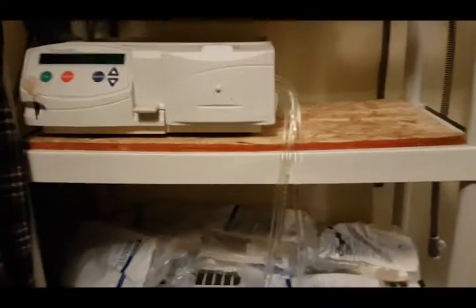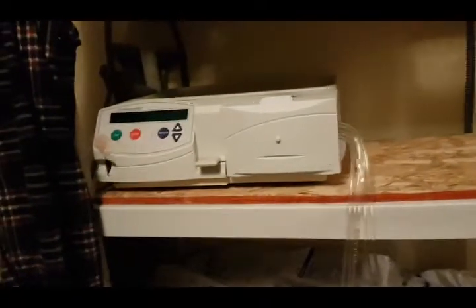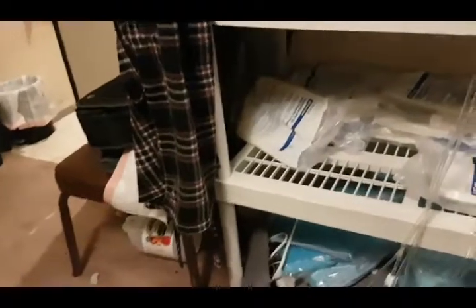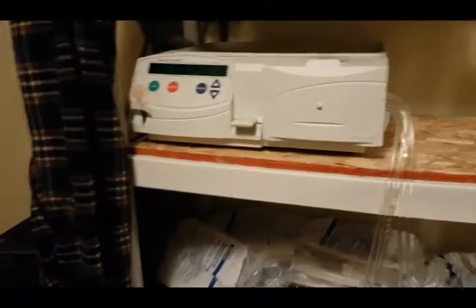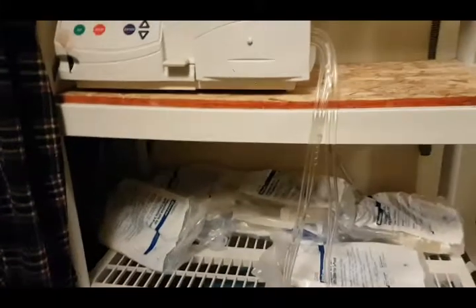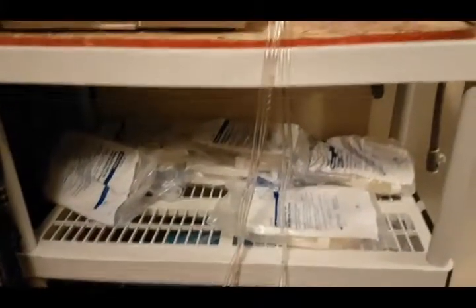And this is a scale that's used. Basically, if you can't get to electricity, or for some other reason, there's something called a manual exchange, which is where you hook one bag up full of solution. You have one bag down on the floor, and you clamp the bag of solution, unclamp the bag to the floor, and let the solution flow out into the waste bag. Then when that's done, you unclamp the tube up to the bag full of solution, let that empty into your abdomen, and then it does the dwell time, and in a few hours, you do it again. And that is basically what I can think of at the moment. We are going to now pause the video and wait until my dad gets back, and he can explain more about it.